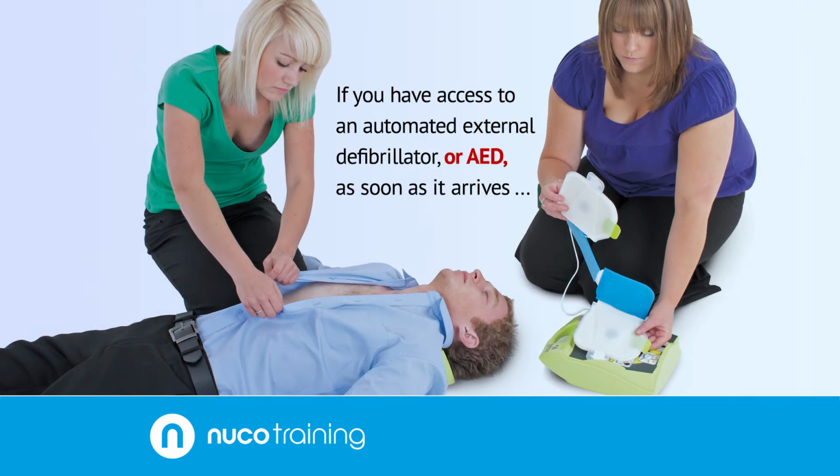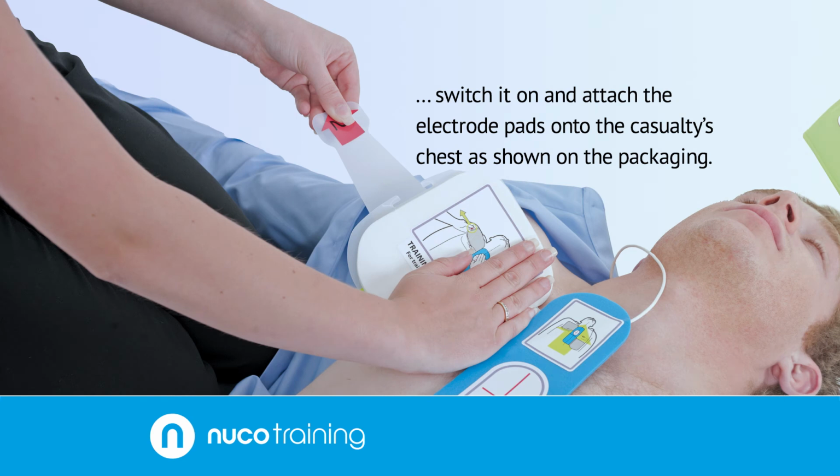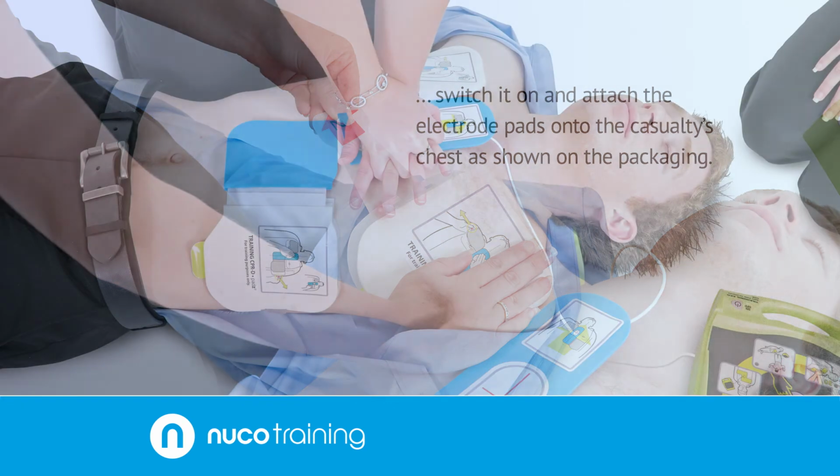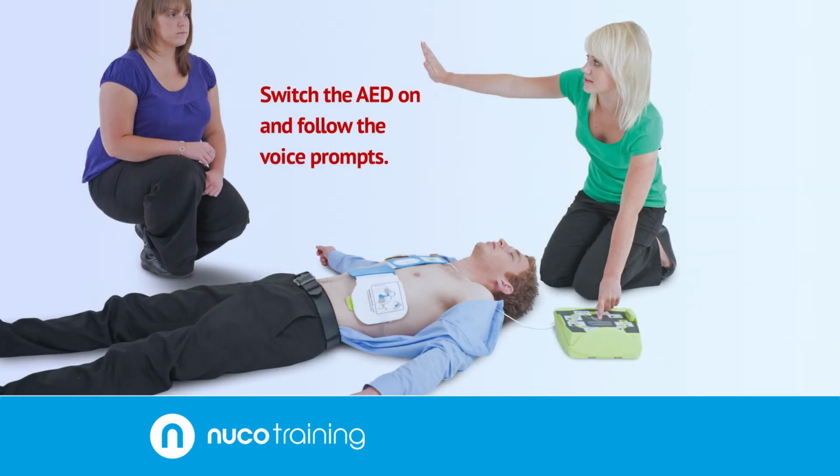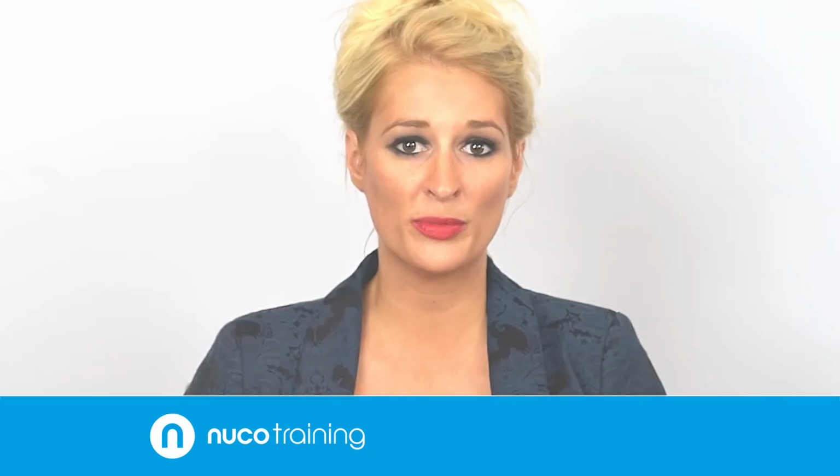If you have access to an automated external defibrillator, or AED, as soon as it arrives, switch it on and attach the electrode pads onto the casualty's chest as shown on the packaging. If more than one rescuer is present, CPR should be continued whilst the electrode pads are being attached to the chest. Switch the AED on and follow the voice prompts. You must ensure that there is no contact with the casualty from anyone, including yourself, unless you are prompted by the AED to continue with CPR.